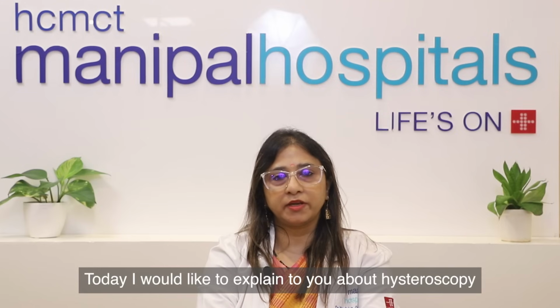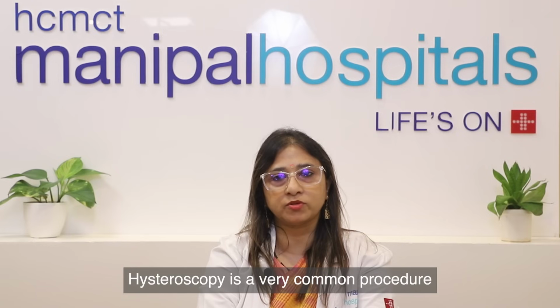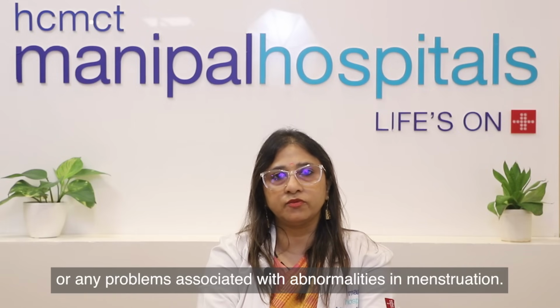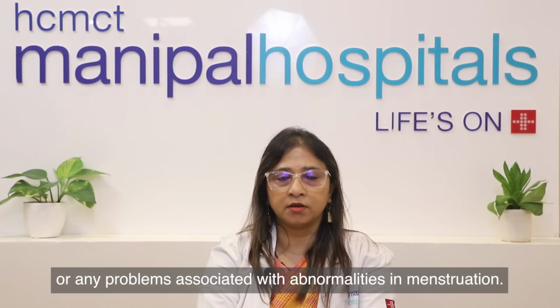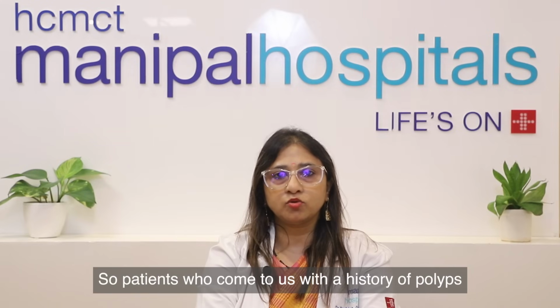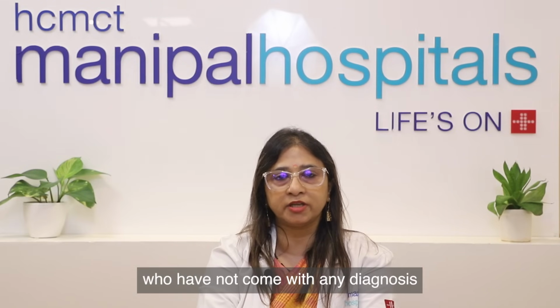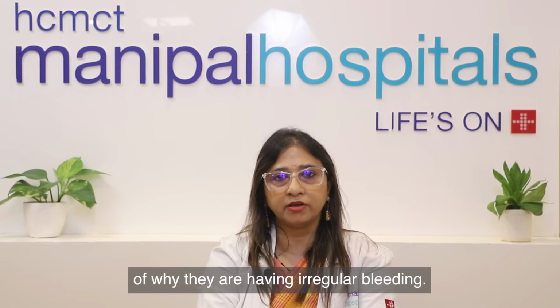Today I would like to explain to you about hysteroscopy and the procedures associated with hysteroscopy. Hysteroscopy is a very common procedure done these days to look for abnormal uterine bleeding or any problems associated with abnormality in menstruation. So patients who come to us with a history of polyp, or who have not come with any diagnosis why they are having irregular bleeding.